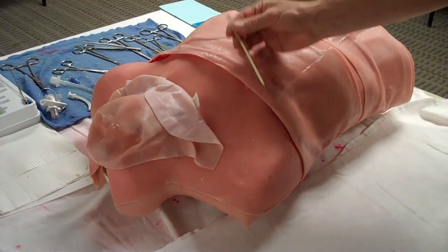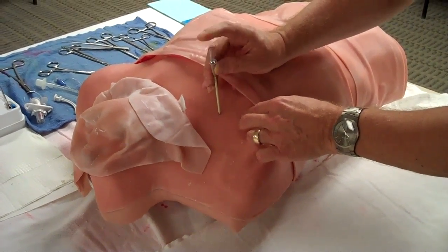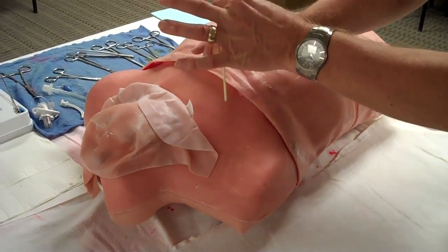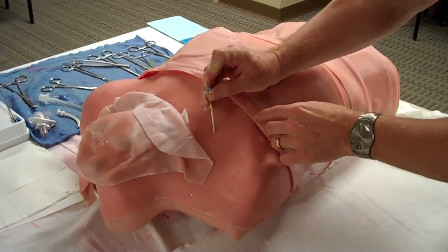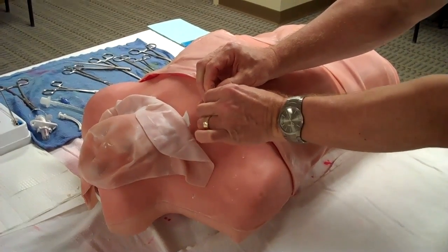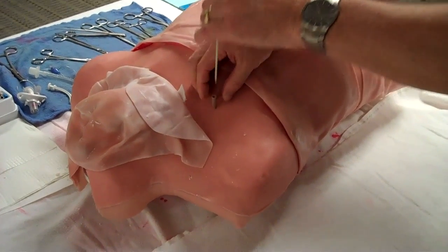All you do is take the catheter, find your spot once it's sterilized, and then push. You have to make sure that you're holding the catheter onto the hub — it's very easy at this point for it to start to slide off and bend. So you've got your spot, start to push, and then as soon as it enters the chest, you should get a great rush of air. Once you've got that, slide the catheter off the needle itself and leave it in the chest.